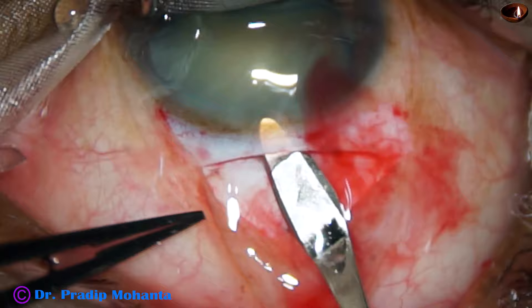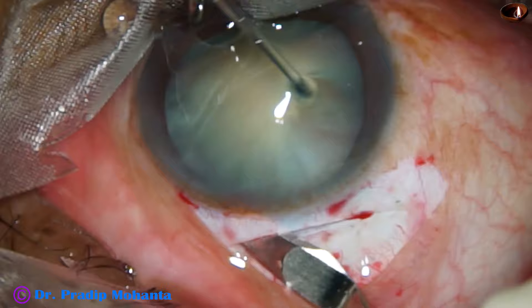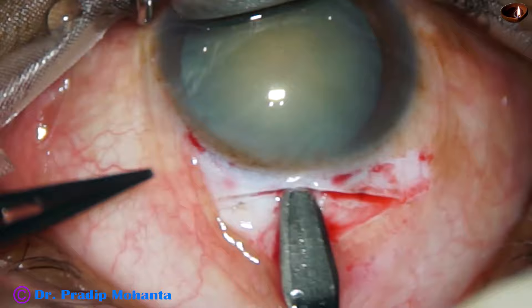I start at the center, go into clear cornea for about 1.5 millimeters, and sweep backward and to the left — and thus I do the tunnel on the left side. This is surgeon's choice. You can do the tunnel from one end to the other end, or from center to the right first and then come back to the left. Now I am making the tunnel on the right side, from center to the right.